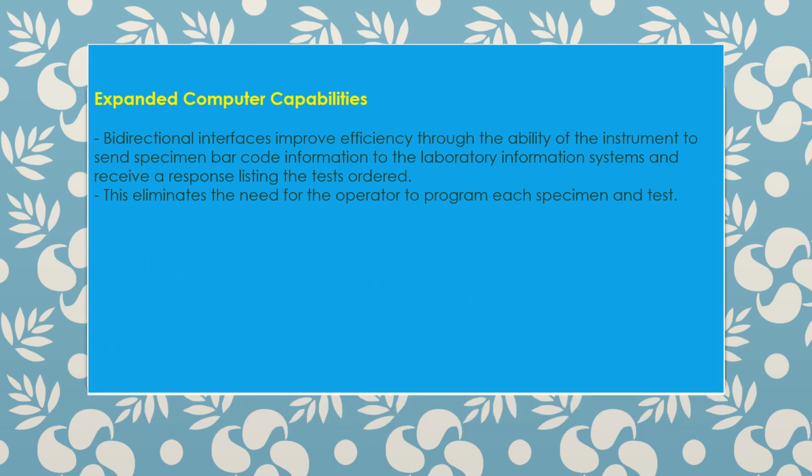Expanded computer capabilities. Bidirectional interfaces improve efficiency through the ability of the instrument to send specimen barcode information to the laboratory information system and receive a response listing the tests ordered. This eliminates the need for the operator to program each specimen and test.